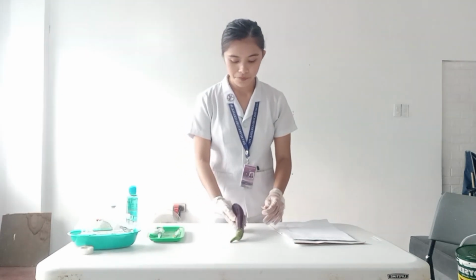With the non-dominant hand, move the skin at the site until it is taut. The taut skin allows for easier entry of the needle and less discomfort for the patient. Now insert the tip of the needle far enough to place the bevel through the epidermis into the dermis.